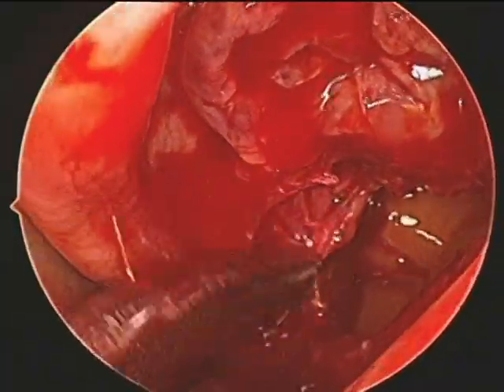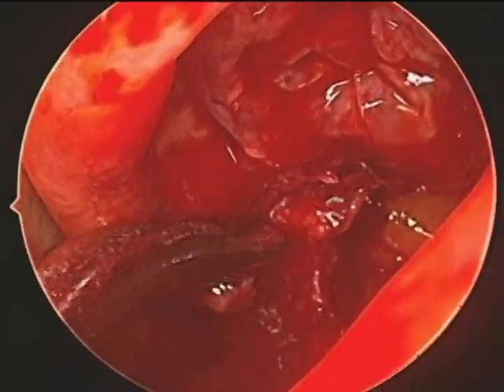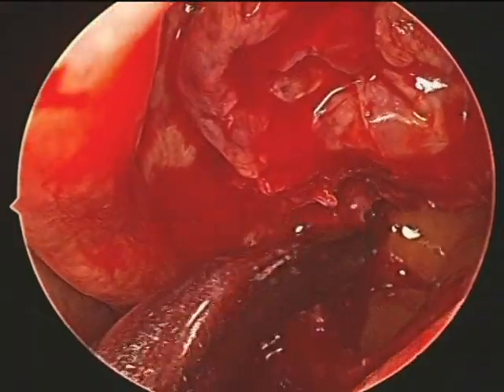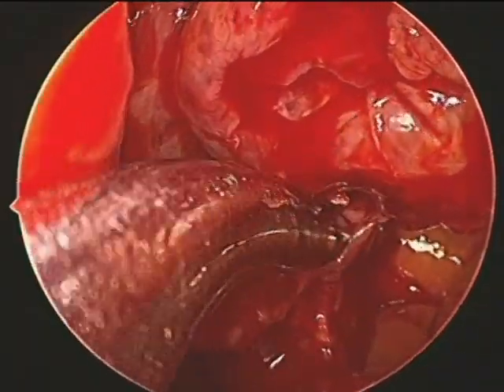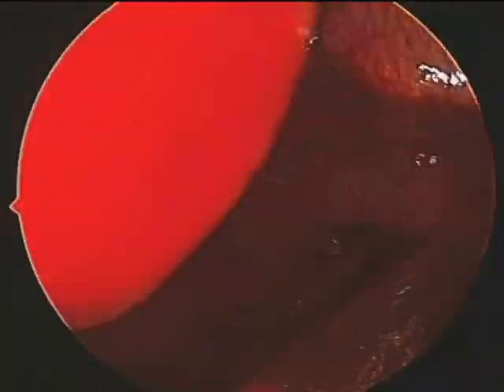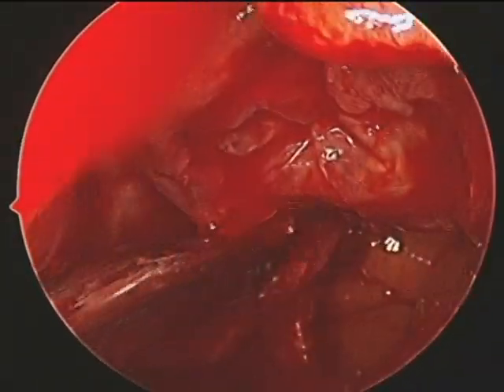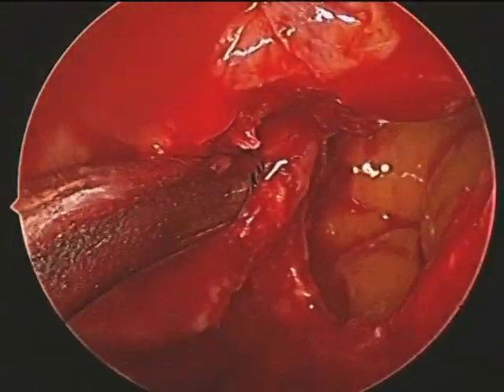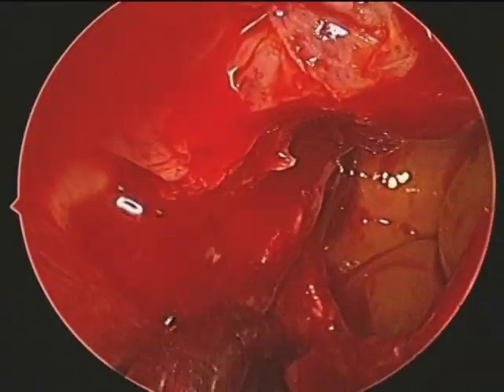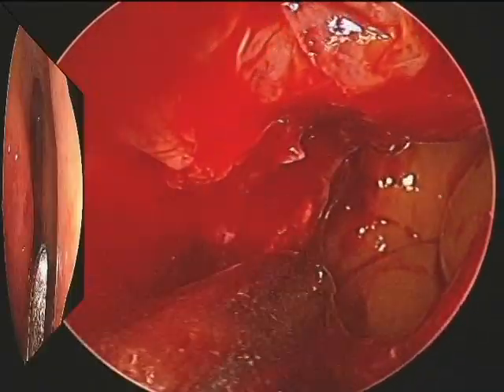Now we can see the mucosa of the left maxillary sinus in the region of the four o'clock position. You can see it is highly edematous and becoming polypoidal — that is the mucosa, intact and yellowing and polypoidal.